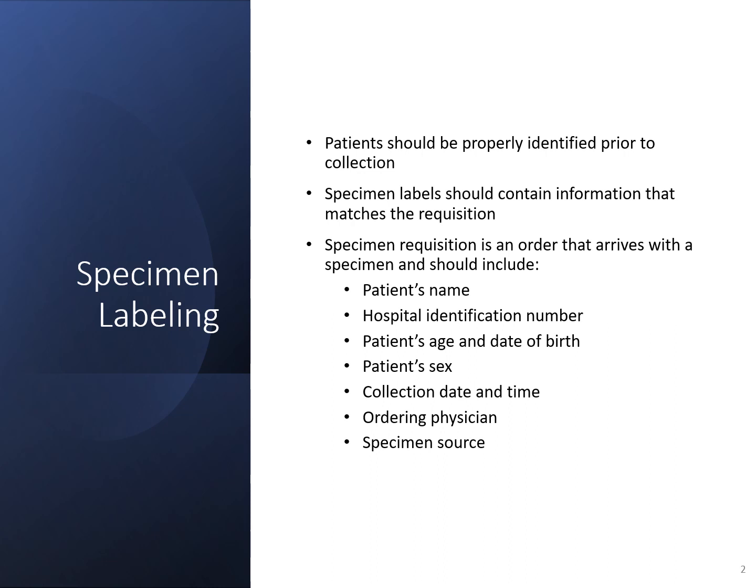So for any specimen that is received into the lab, of course, it should be labeled. When collecting a specimen, you should always make sure that you properly identify the patient, or the phlebotomist should properly identify the patient before collecting the sample. If it's something like a wound culture or any other tissue culture, then the physician may be the one to collect that. It should be labeled, and of course it should be labeled at bedside, at the patient's side. And it should contain all of the necessary information, as well as match the order that comes with it.